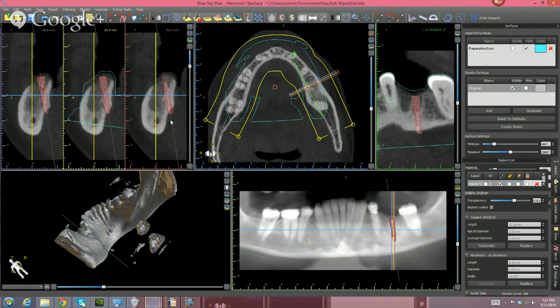I have a friend of mine who was doing surgery and hit a home run on it, and actually had to go outside the mouth with this gigantic suture and come all the way around the inside and close it off. Now, people look at this and say, oh my God, I'm never doing implants. I could hit some structure in the submandibular fossa. The answer is the same as the picture of the cliff. Don't go there. That's why you have cone beams.